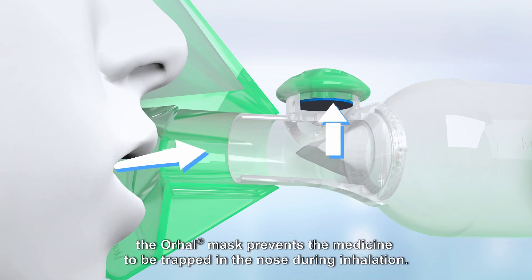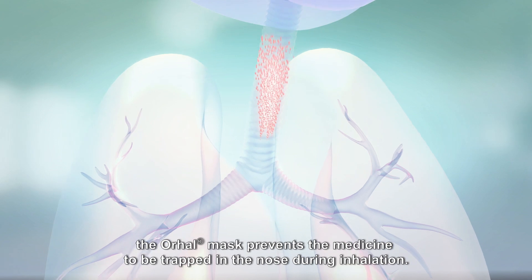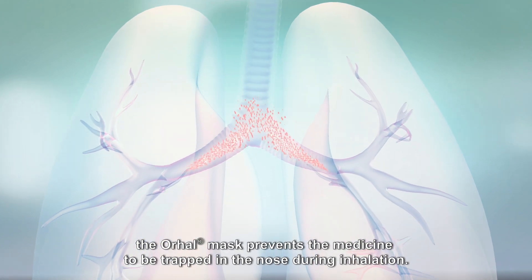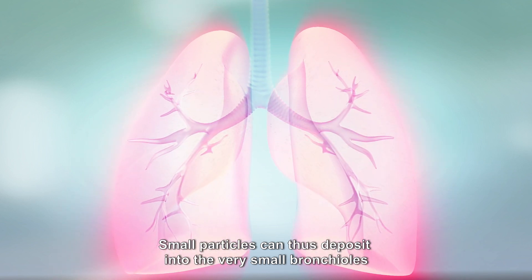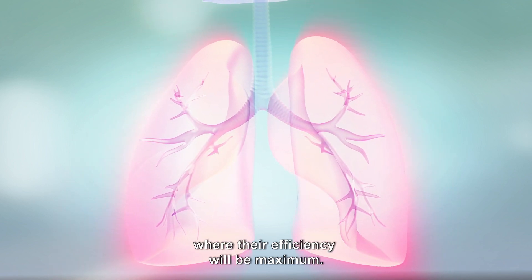Thanks to its partition, the oral mask prevents the medicine from being trapped in the nose during inhalation. Small particles can thus deposit into the very small bronchioles where their efficiency will be maximum.